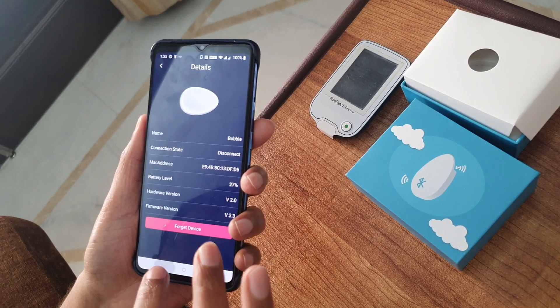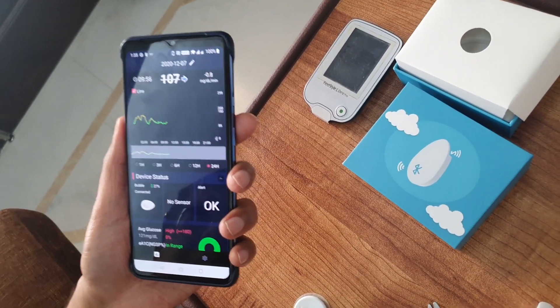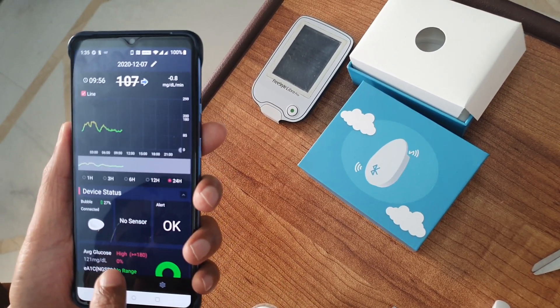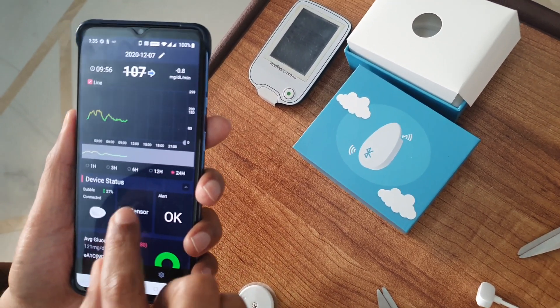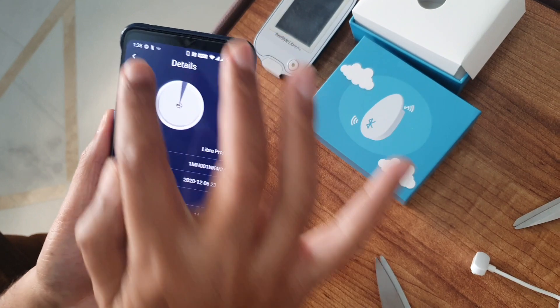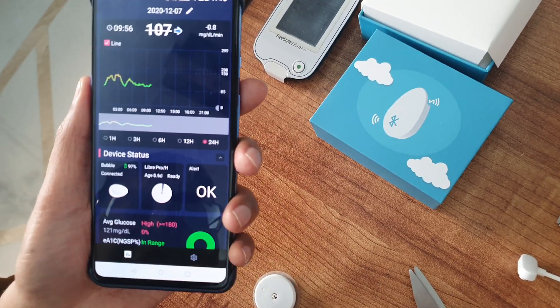It is connected and now it shows connected. Just give it a moment.